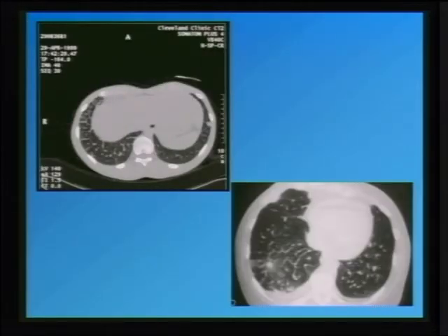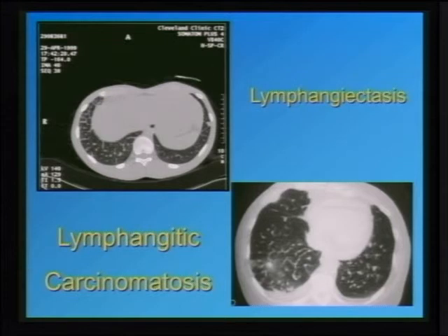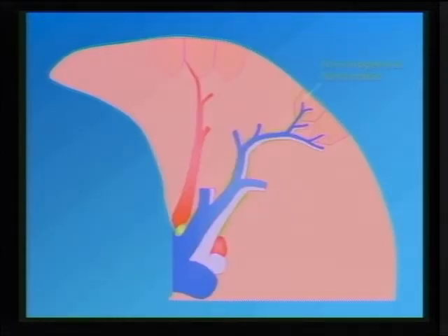So we talked about lymphangiectasia, and then there's this case here. Now look at the difference between this one and that one. This one in the bottom shows that there is thickening of the interlobular septa, but look at this nodular characteristic of this nodular septal thickening. And not that many things can give you nodular septal thickening. And you can see again here, and you can see it here. So in the right setting, this is a patient with lymphangitic carcinomatosis. So again, knowing that the lymphatics live there, and knowing that when you have deposit of tumor, they can be nodular, it gives you this typical appearance we call the beaded appearance of the interlobular septal thickening.